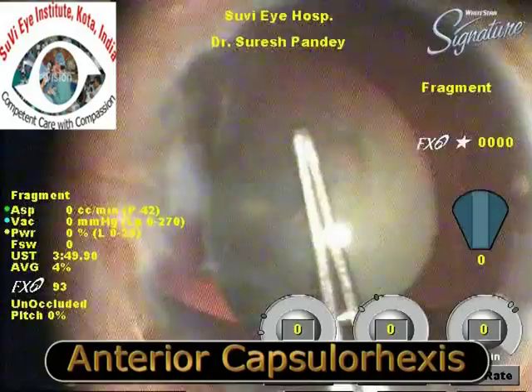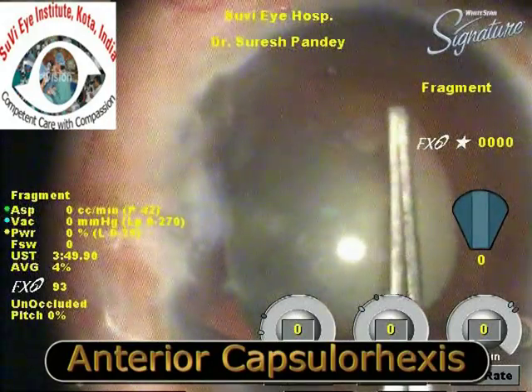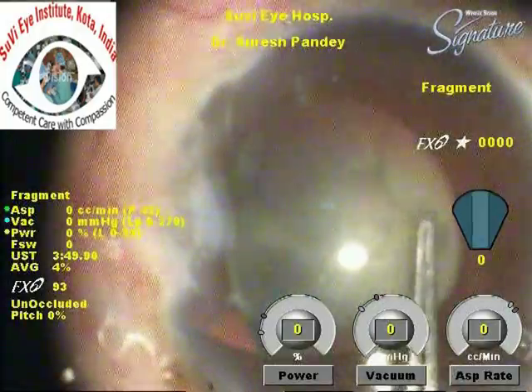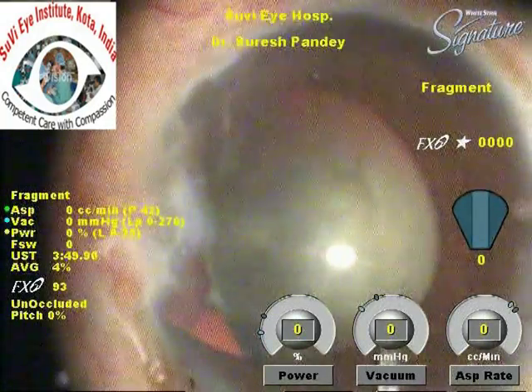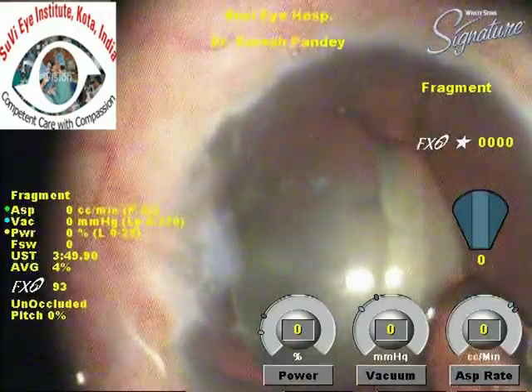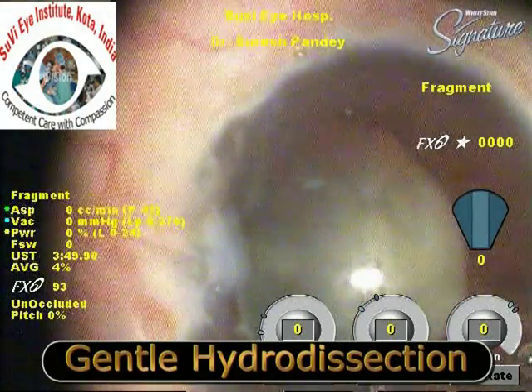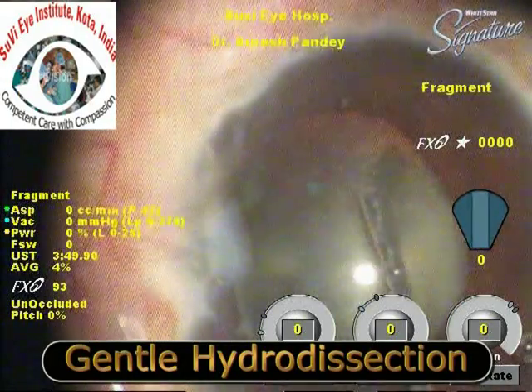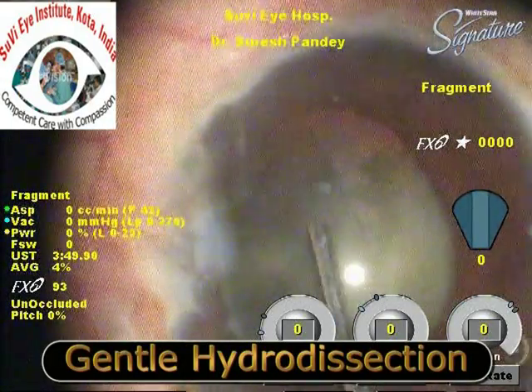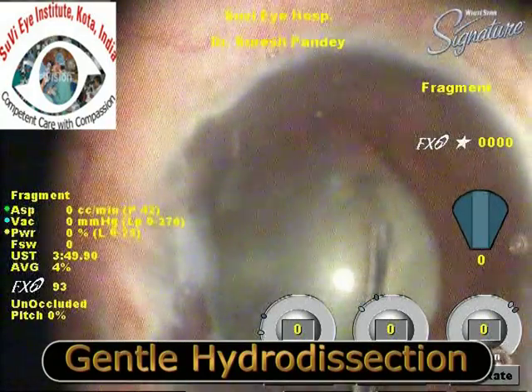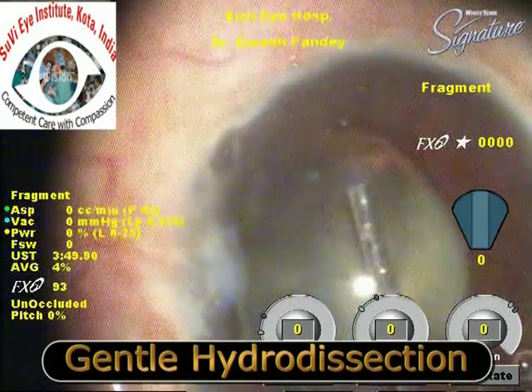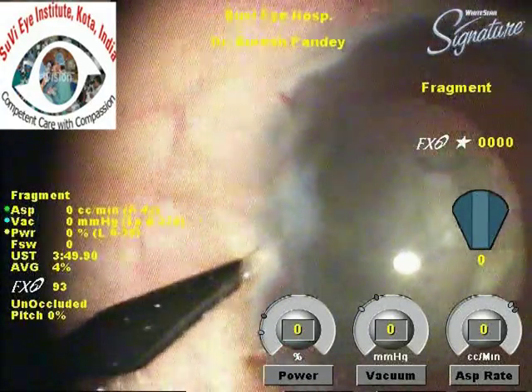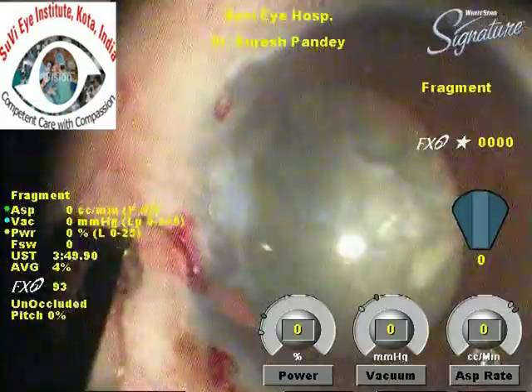The capsulorrhexis is difficult in these cases as there is no counter-traction on the anterior capsule. It should always be initiated in the area away from the capsular dehiscence, and if counter-traction is very low, a second instrument can be used to provide it on the capsular surface. A gentle hydrodissection is performed — this is important because if cortical fibers are not freed, pulling on them may risk enlargement of the area of dehiscence.